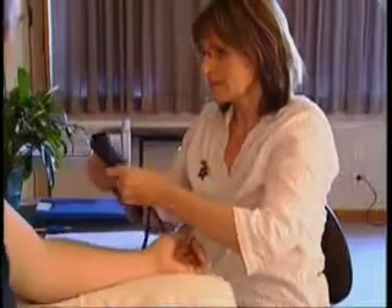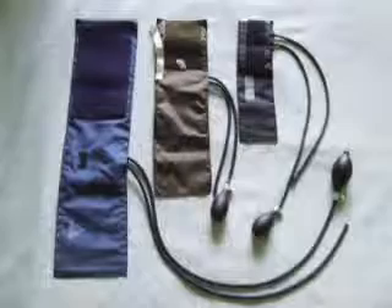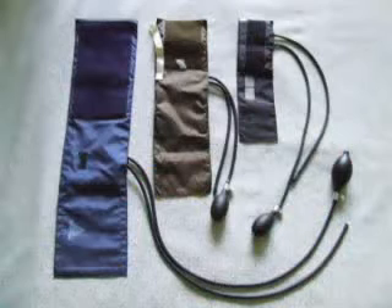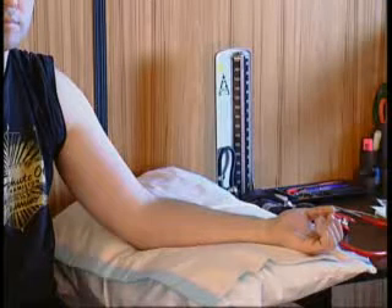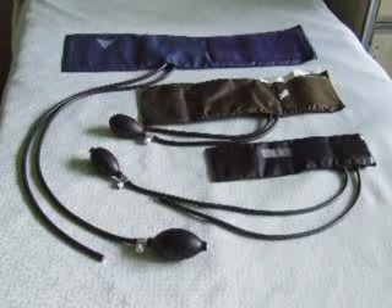Selection of appropriate size cuff. The cuff size is selected by assessing the size of the limb on which the measurement is to be made — usually the upper arm, but maybe the thigh if necessary. The width of the blood pressure cuff should be about two-thirds of the length of the client's upper arm, from axilla to antecubital fossa. The length of the bladder inside the cuff should encircle two-thirds of the arm of an adult and the entire arm of a child. An incorrect cuff size will give an inaccurate reading.